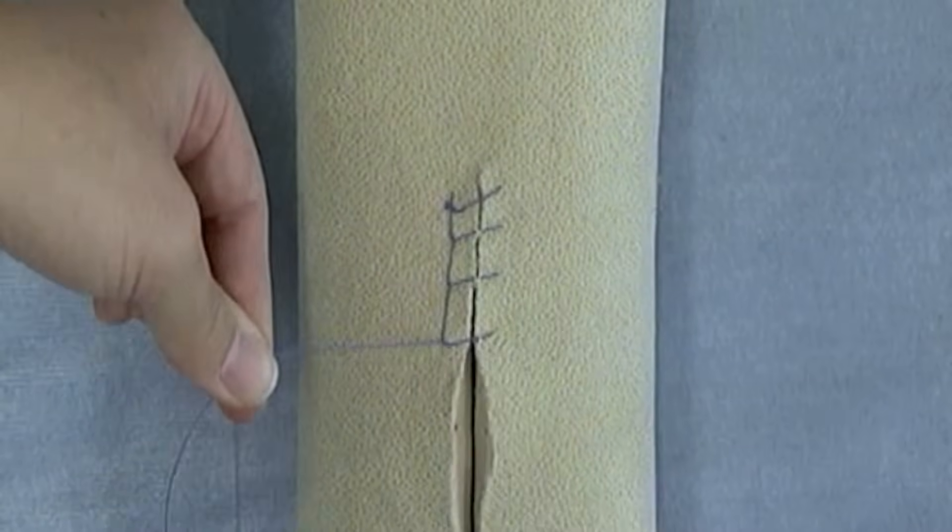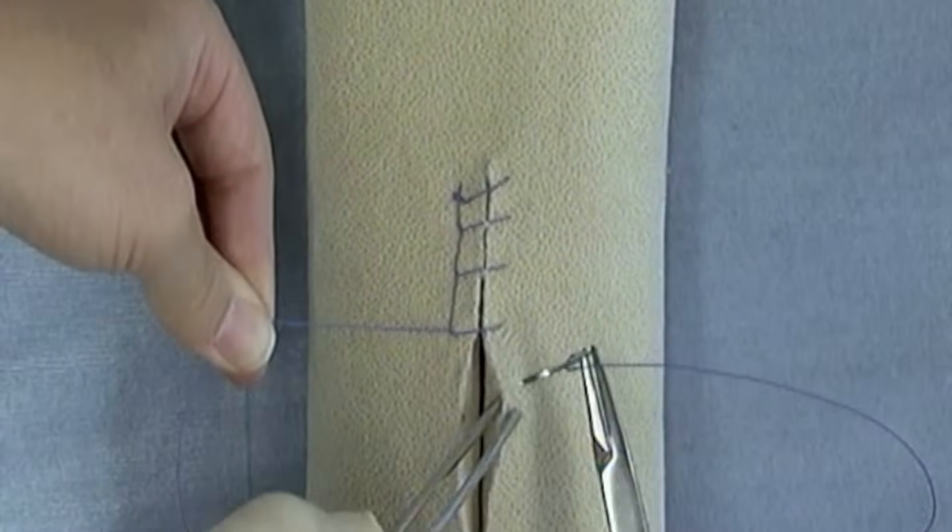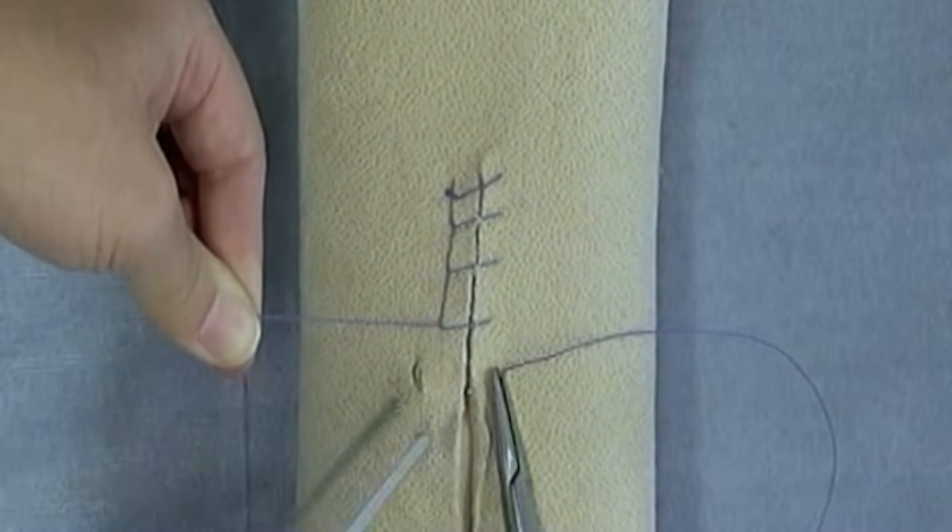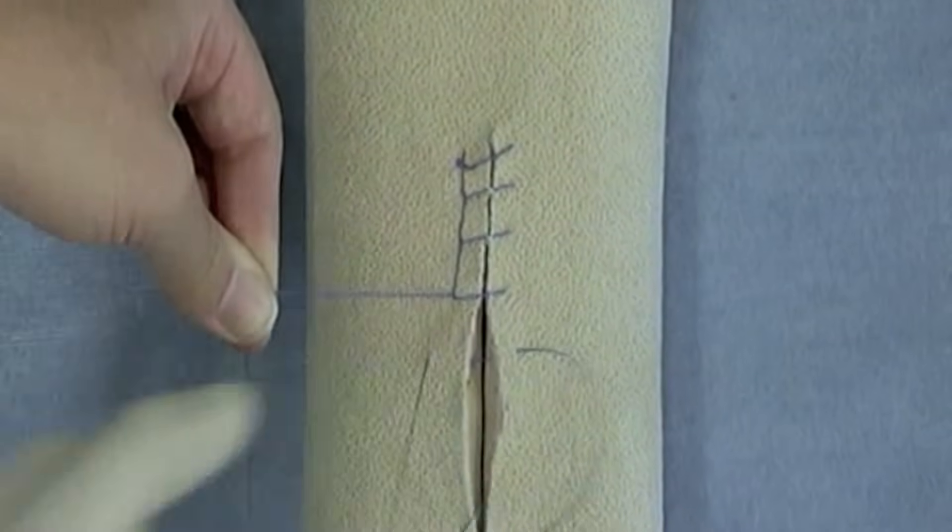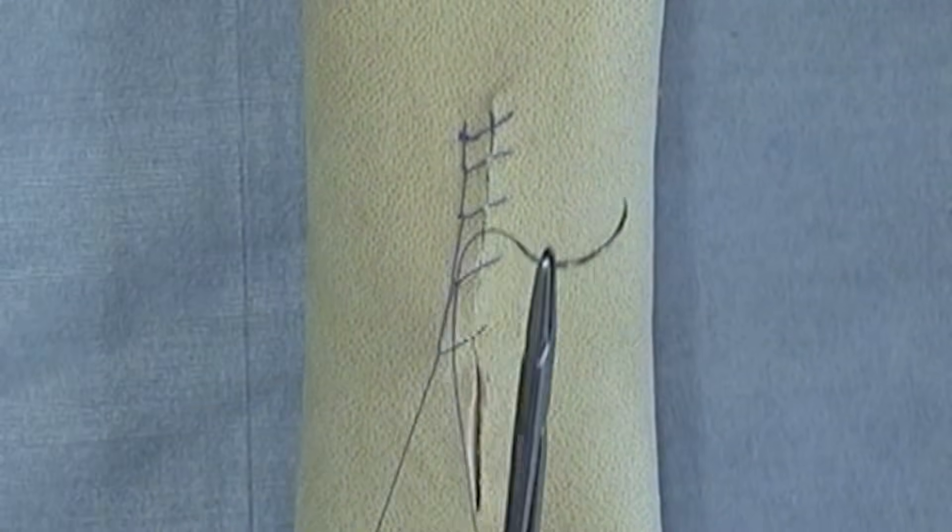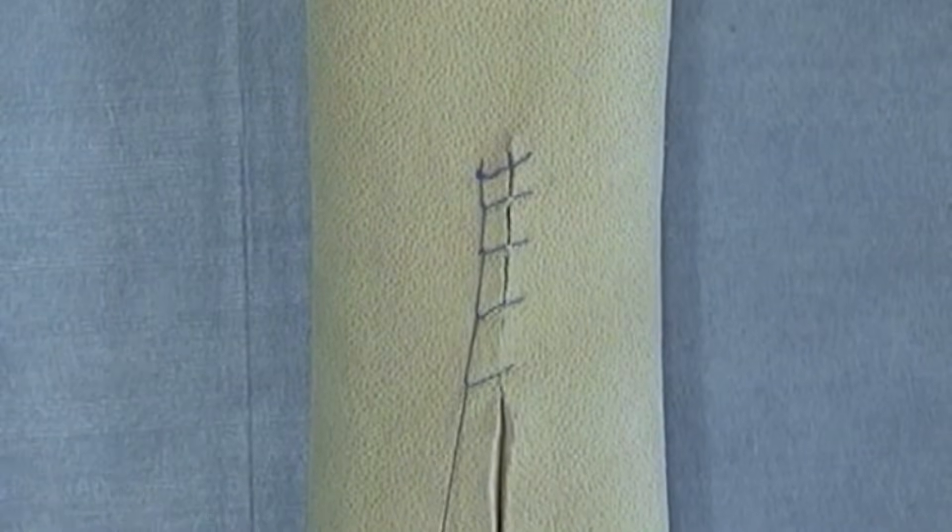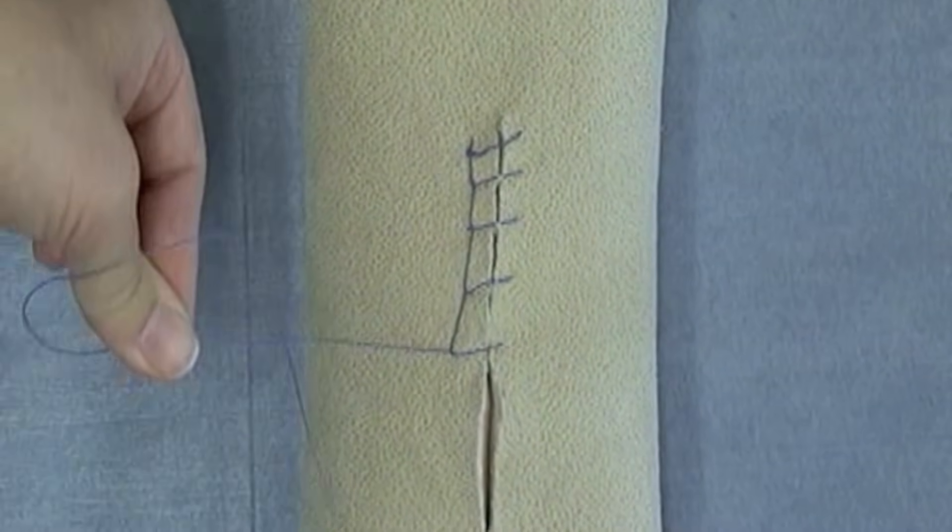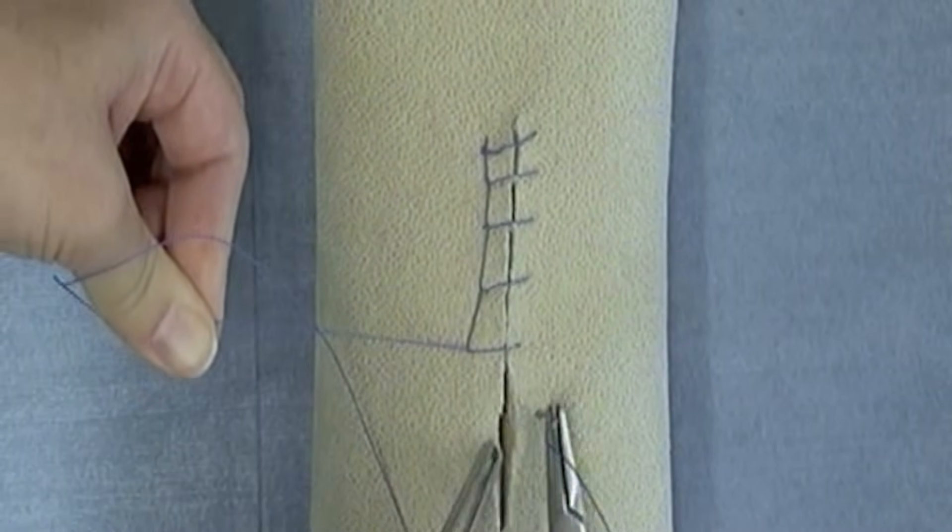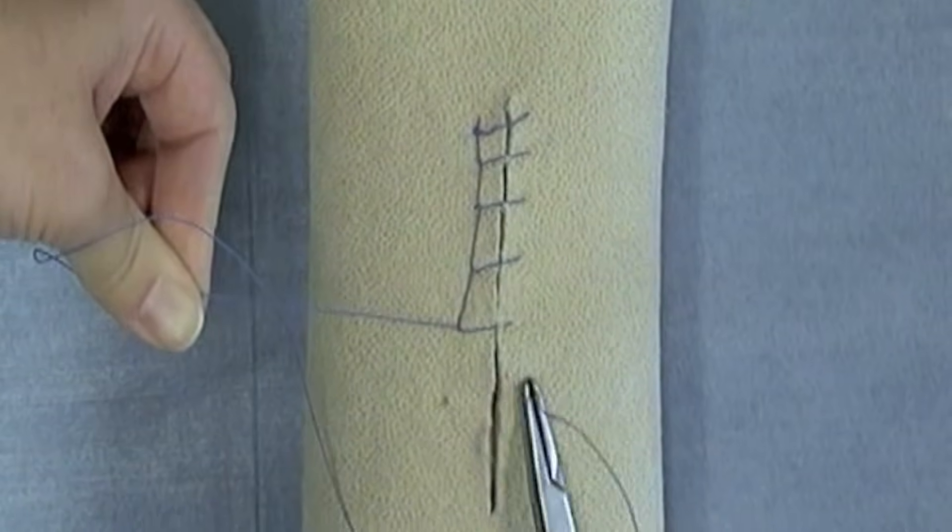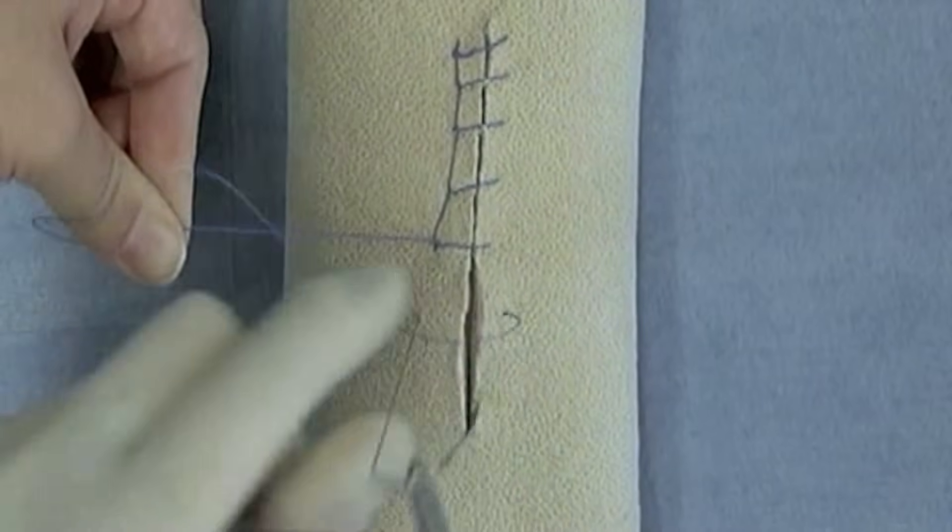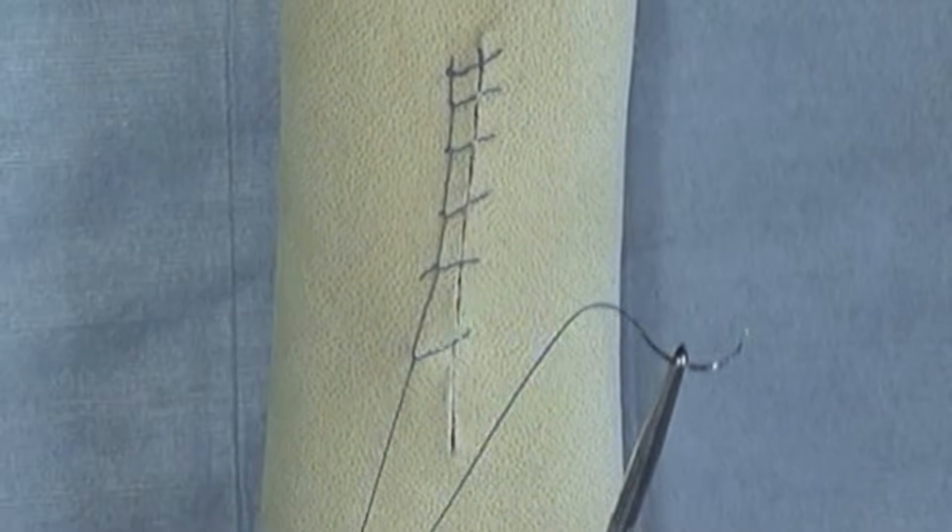You can see here that very nice even tension on both sides of the incision.